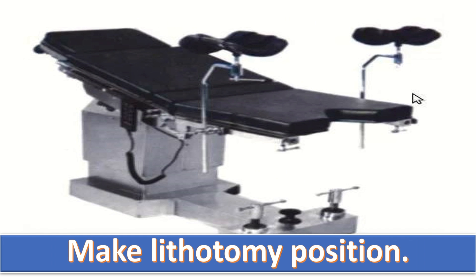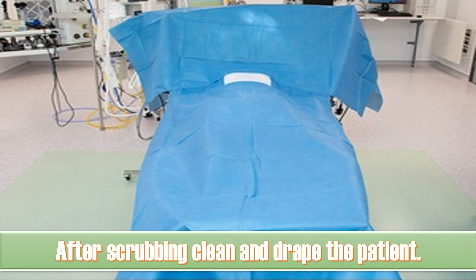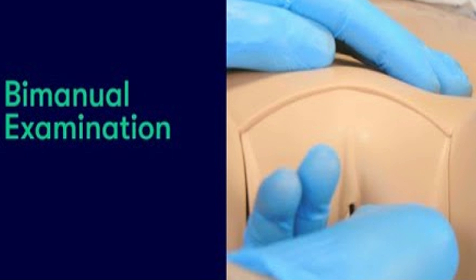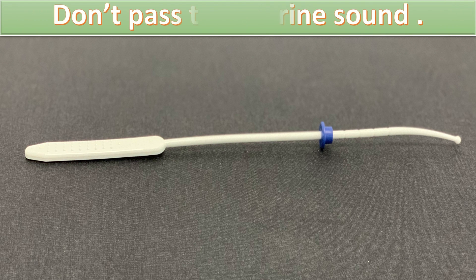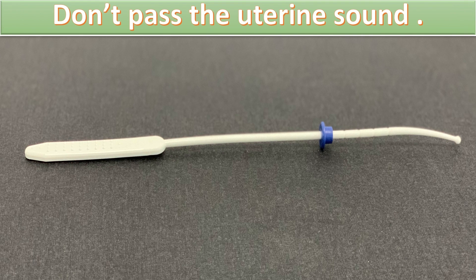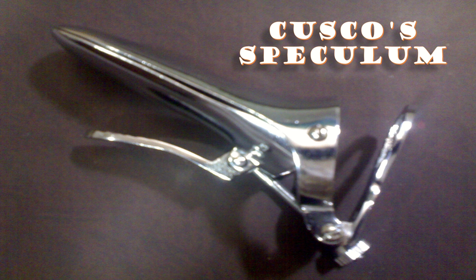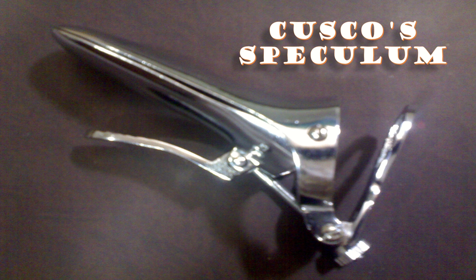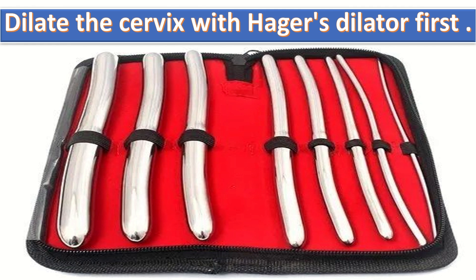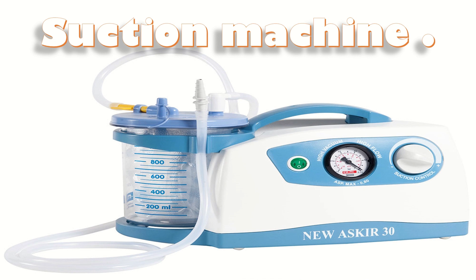Place the patient in an appropriate lithotomy position, as this procedure is performed in lithotomy position. After scrubbing, clean and drape the patient. Do a bimanual examination and assess the uterine size. Do not pass the uterine sound because there is an increased risk of perforation in such cases. Under good light, pass a Cusco speculum to visualize the cervix and clean it with three swabs. If the cervix is not sufficiently dilated, dilate it with a Hagar's dilator.